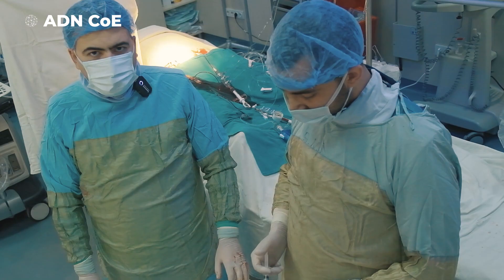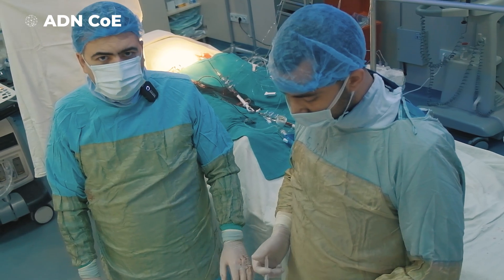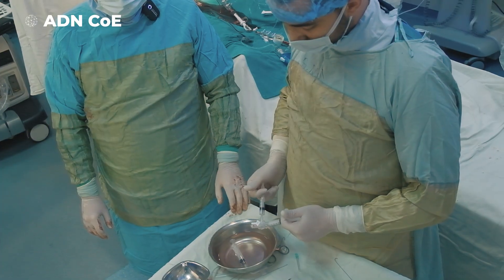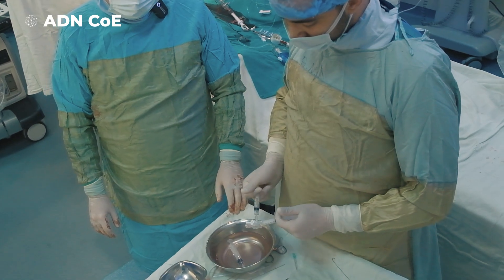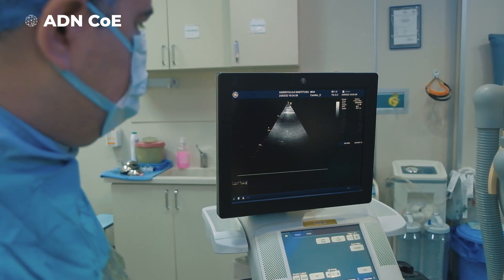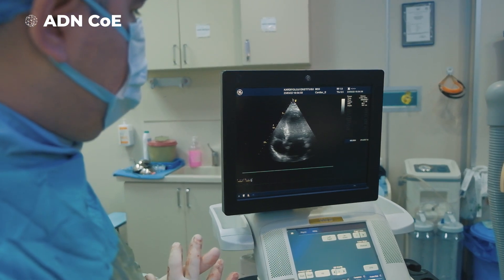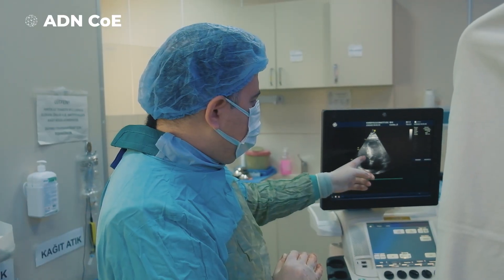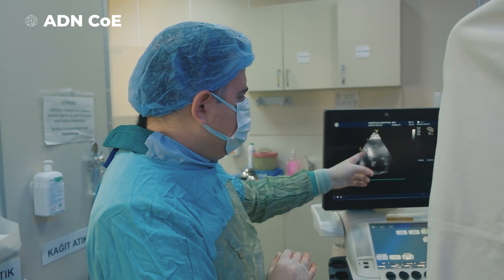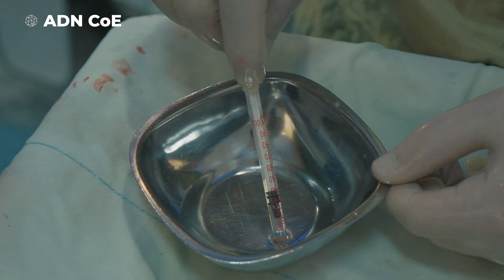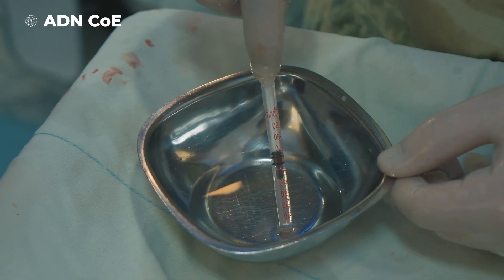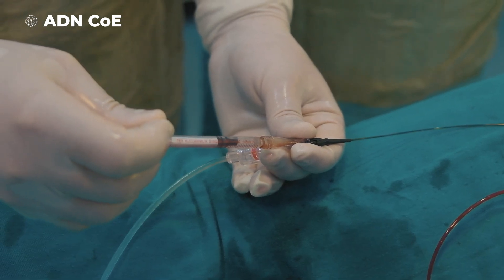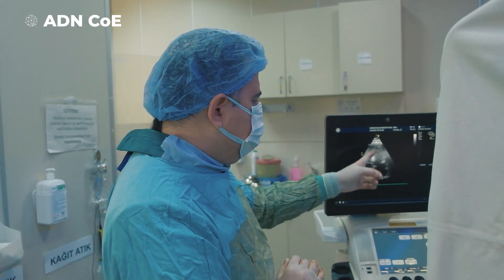In this procedure, we are performing contrast echocardiography and you can see that we are preparing our contrast agent. We performed contrast echocardiography and we can now see the involvement of the contrast agent at the basal and mid portion of the septum. We are also confirming that the contrast will not go to any other part of the left ventricle.